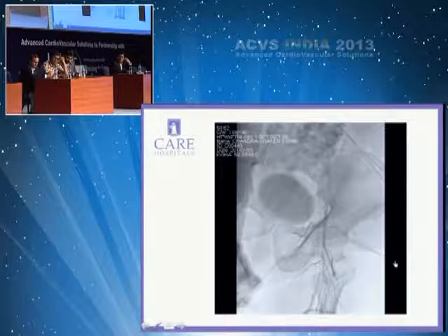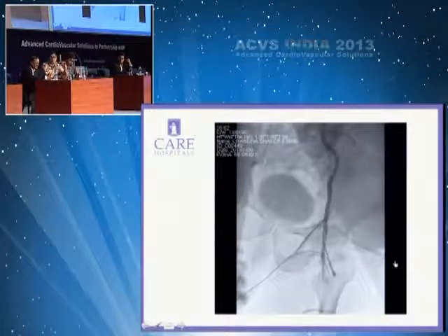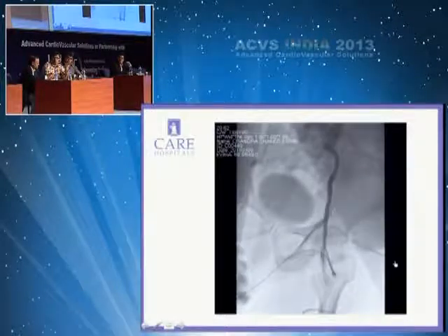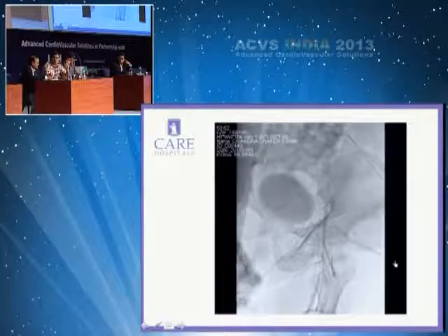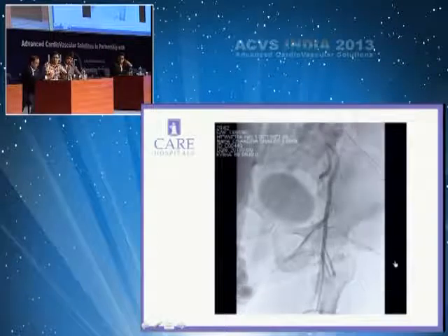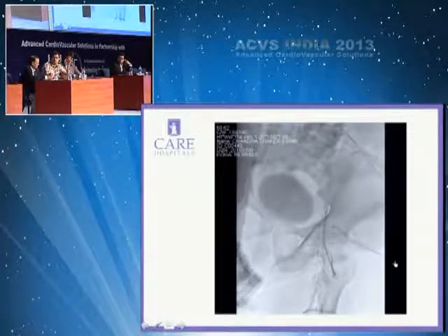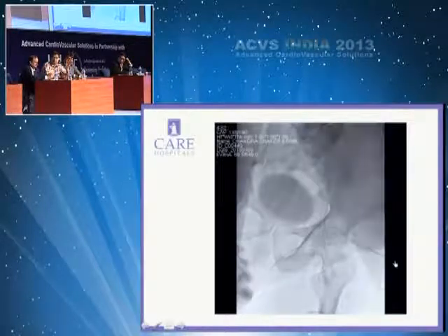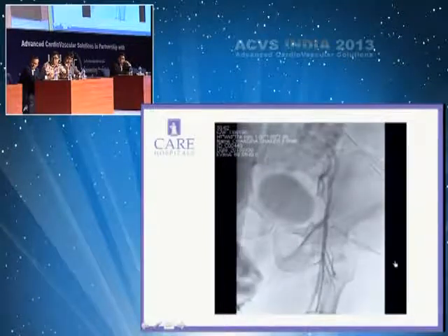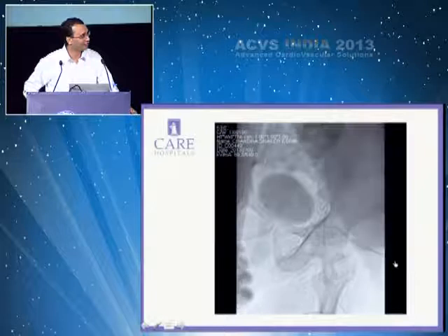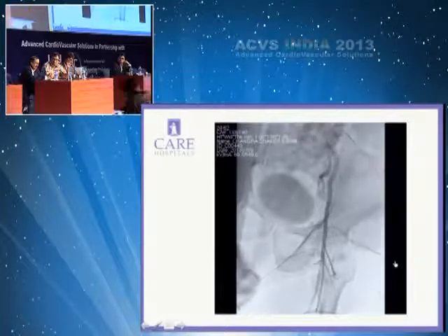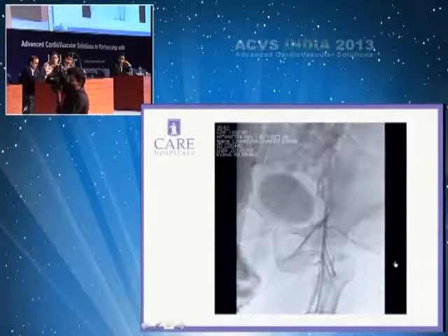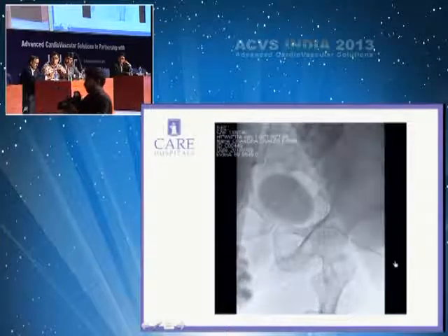Probably he had a plaque rupture there. The choice of stent length is interesting as well as the choice of stent itself. The limitation of ostial left main stenting is that the left main is generally short and you try to use as short a stent as possible — ideally an 8mm or at most a 9mm stent. Putting a 16mm stent is something to note. The second interesting point was the choice of the Promus Element stent, because a little bit of the stent would be protruding into the aorta, and Promus stents are a little more liable for longitudinal stent deformation issues.